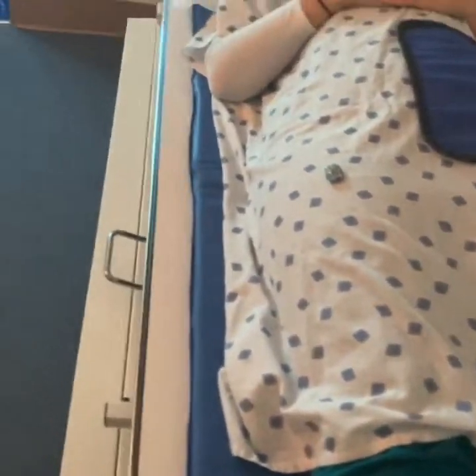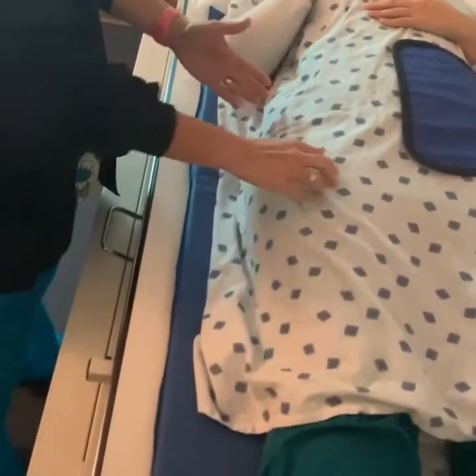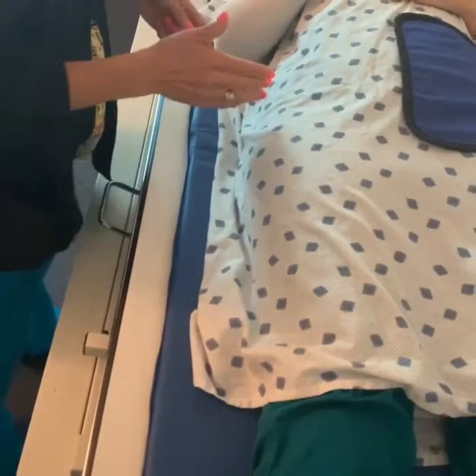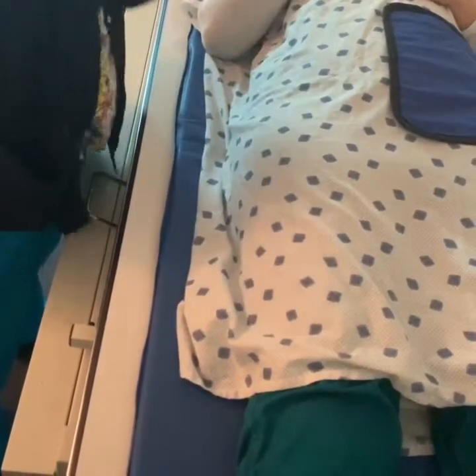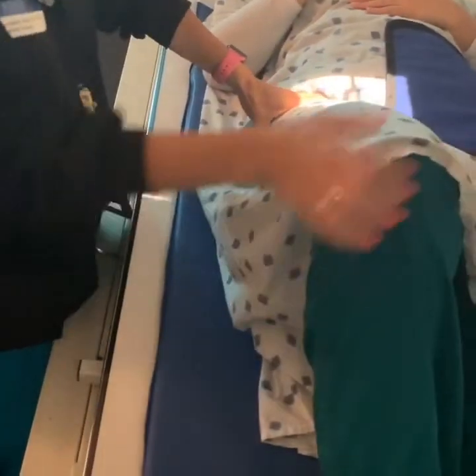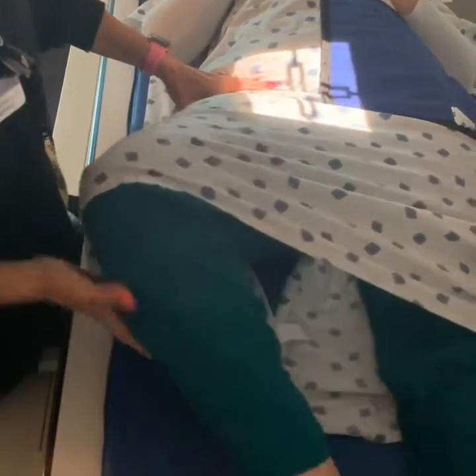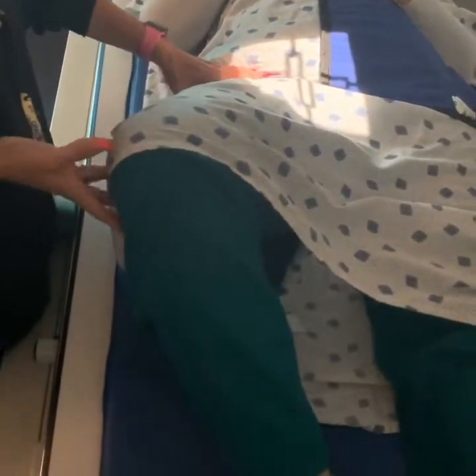All right. Now we've done AP distal, AP proximal. Now we're going to do a lateral of the proximal. So what I'm gonna do is have her bend her knee and let your leg come out towards me. Just about, right about there. I'm gonna move this for a second.